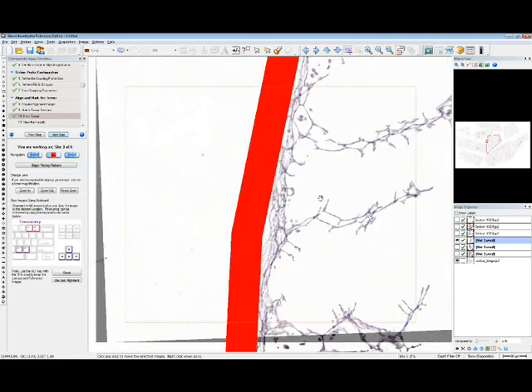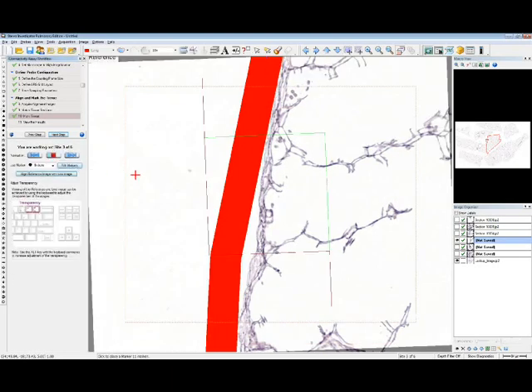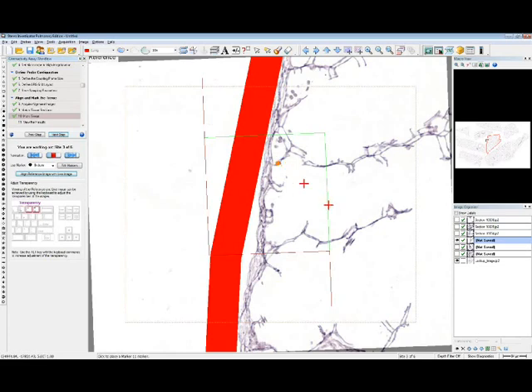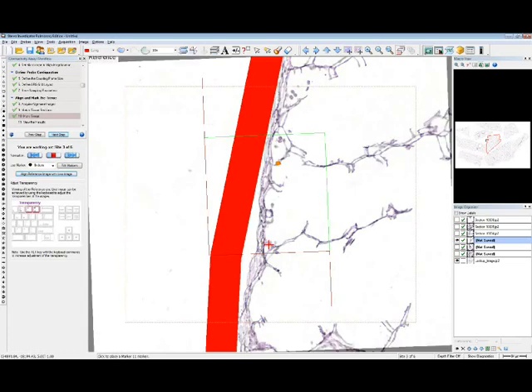So let's go in here, line up our next piece of tissue here. And we'll go ahead and begin placing markers again. And again, this is our counting frame. And we have no bridge over here, but we do have a bridge in the next one, so we'll count that. And the same thing in the bottom, there is no bridge over here, but there is a bridge in the next one, so we'll count that.